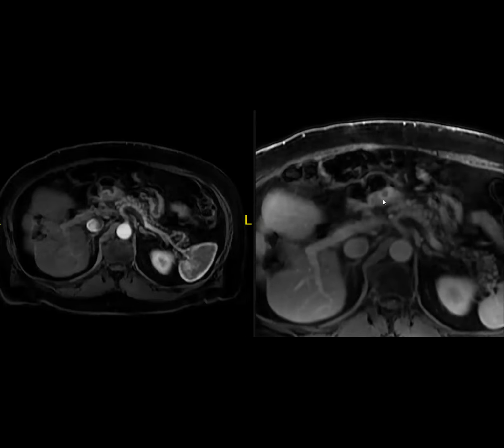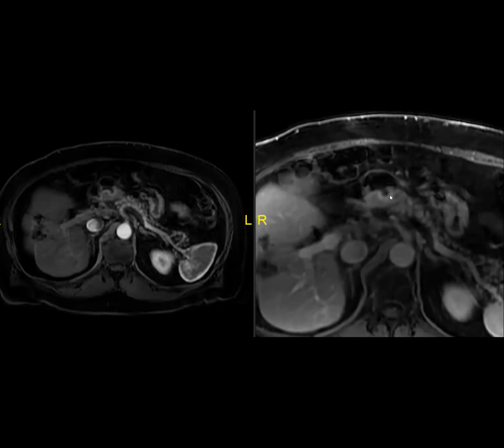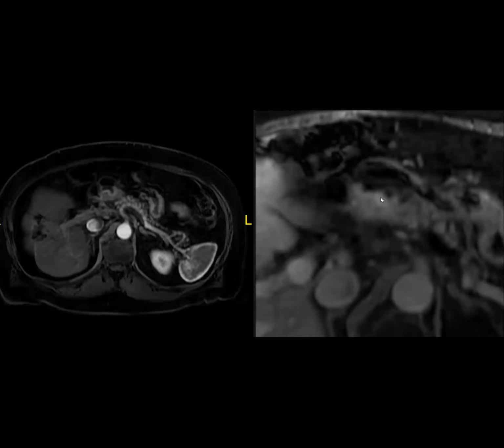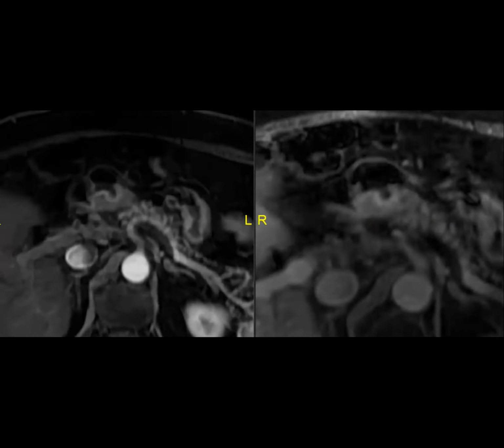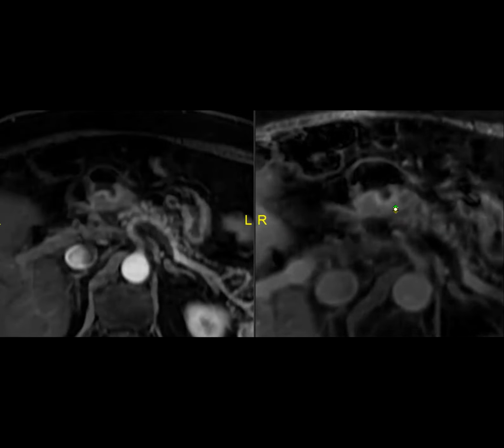This is the stomach, right? And you can see that there's posterior gastric wall thickening and kind of like this little crater, right, with little overhanging edges. You can see it on earlier contrast, and this is MRI. So it looks like instead of a benign ulcer, it looks more like a malignant ulcer, like an ulcer within a mass.